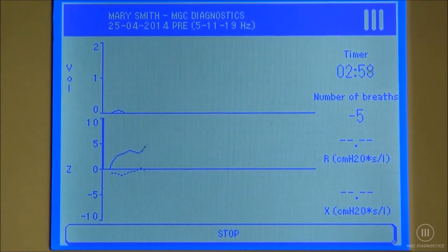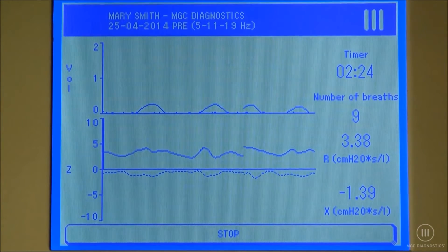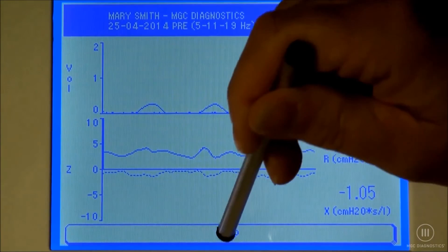We're just breathing in and out as normal as you can. Eight, nine, and ten. Wonderful. Go ahead and come off.